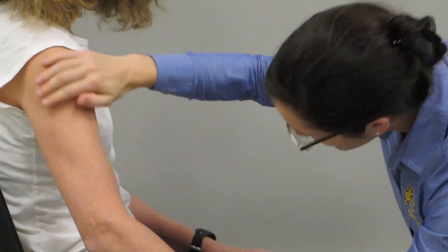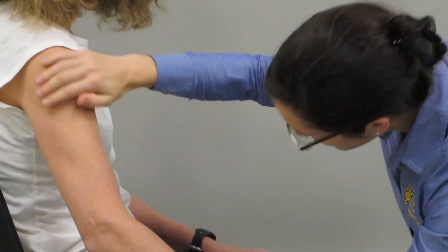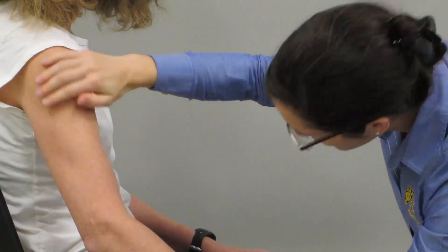Manually resist elbow extension to locate the central point of the bulk of the muscle belly of the lateral head of the triceps and denote this location for EMG sensor placement. Prepare the skin by removing dead skin cells.